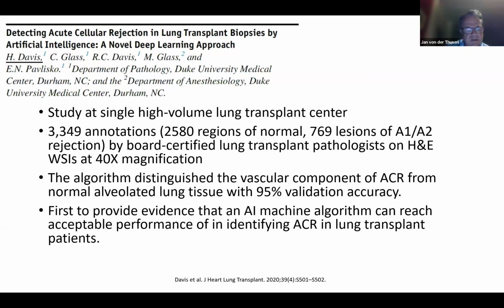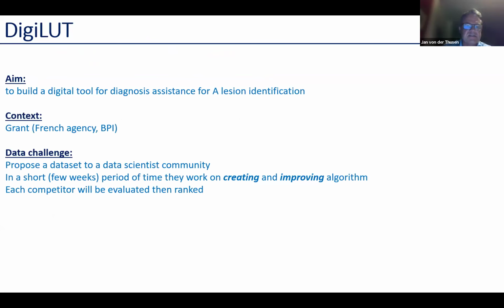If you're looking at designing these models, at training these models, I think the ideal, of course, is that you would have something that recognizes all of the various histological appearances, but in reality, it is sometimes too difficult to do that in first instance. And that's borne out by the second study, which is one that many of us have been involved in, also some people on this call today, including myself.